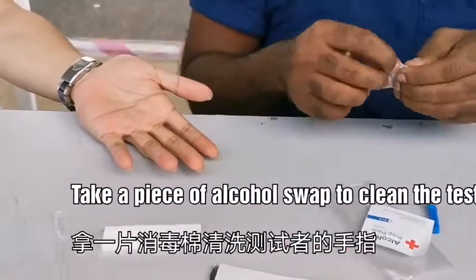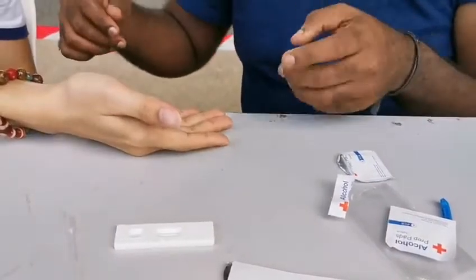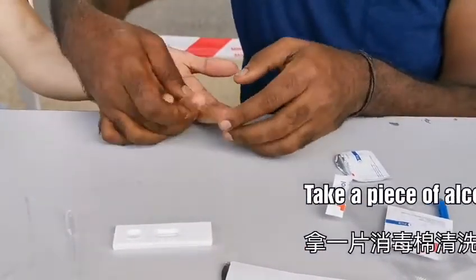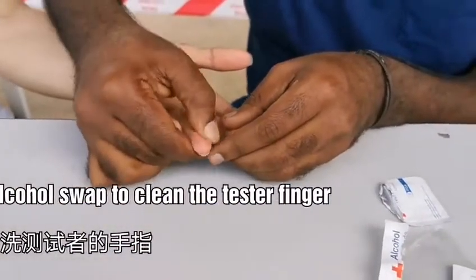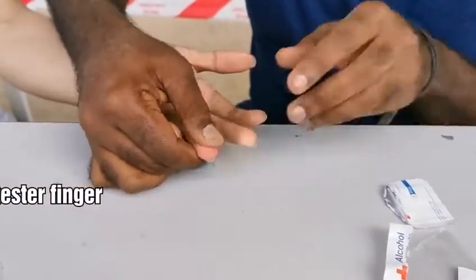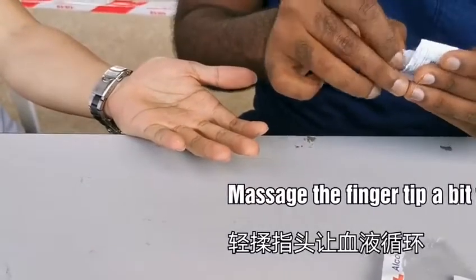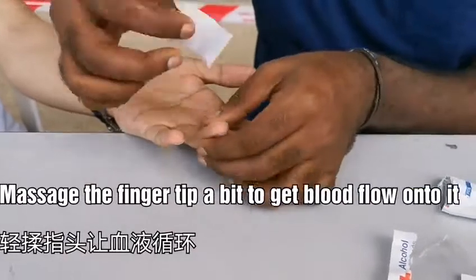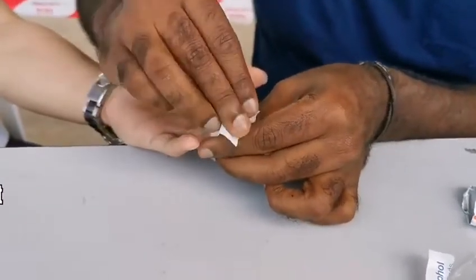You have to clean your finger first with an alcohol swab and clean the test kit. Do a simple massage to get the blood onto the tip of the finger, then disinfect the tip of the finger.